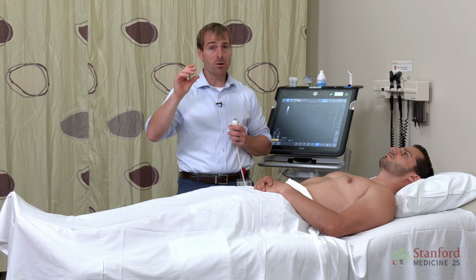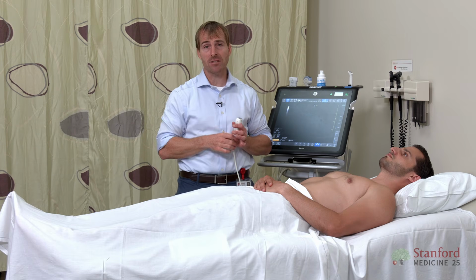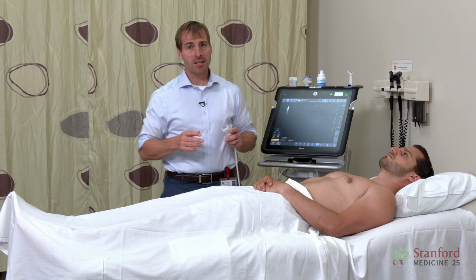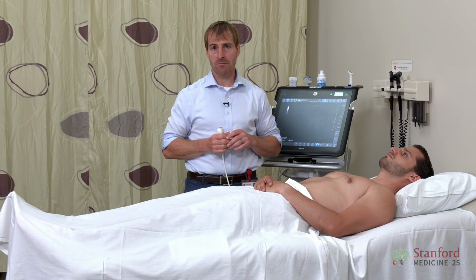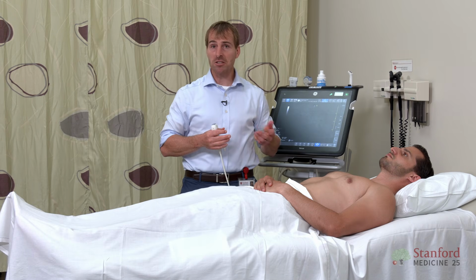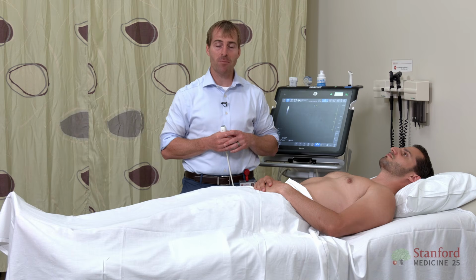Now, if it doesn't collapse 50%, if you see it kind of barely moving, you need to take that into account. And now you should be worried that their central venous pressure is elevated. Now, the difficulty of this scan is, again, as with everything we do in POCUS, you need to bring in some clinical context. So not all sniffs are created equal. Our patient today was very good at generating a nice, clean sniff and collapsing his IVC. But that's not going to be every patient.